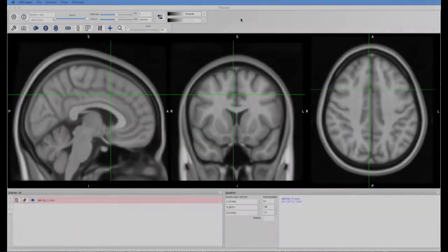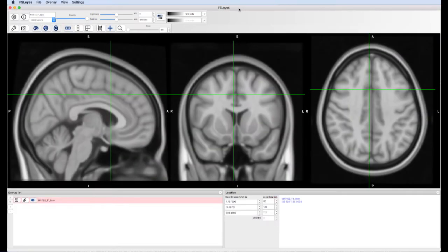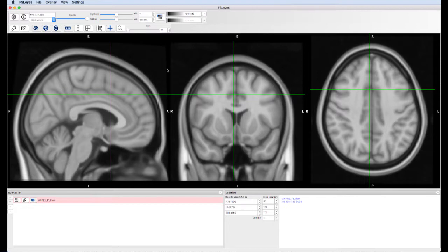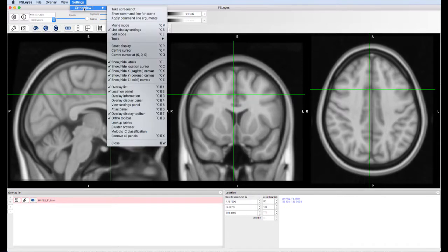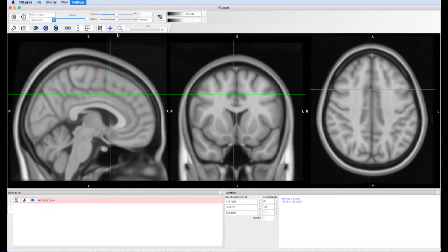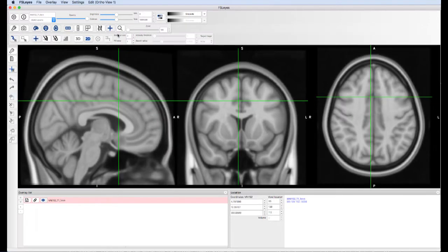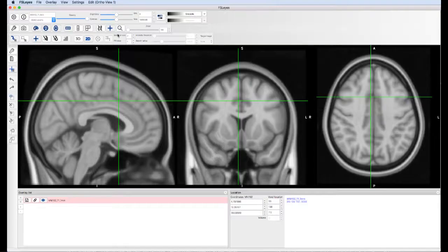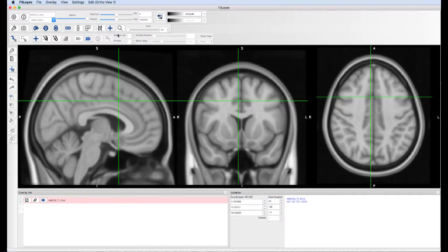Another way you can create ROIs in standardized space is to draw them yourself. Click on Settings, Ortho View, and then Edit Mode. This will display additional toolbars for selecting and drawing voxels. Here we'll cover the basics.